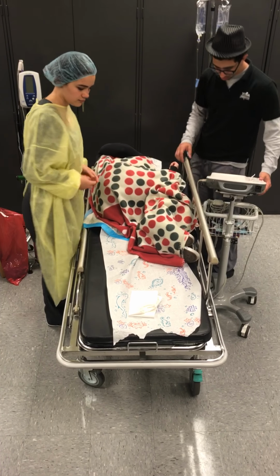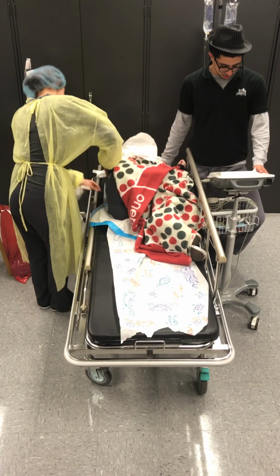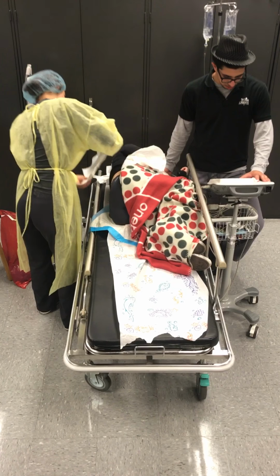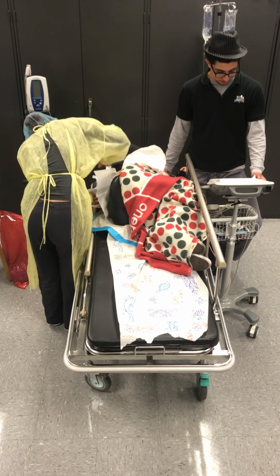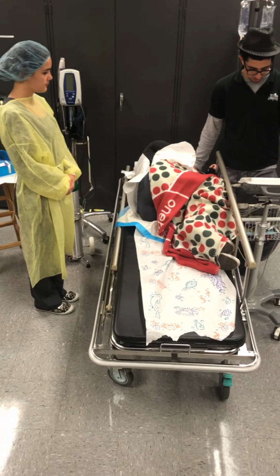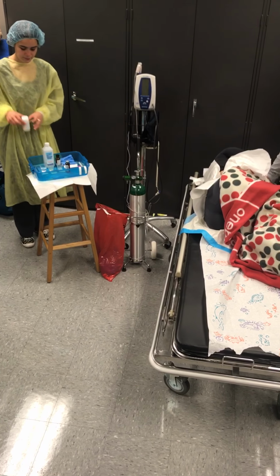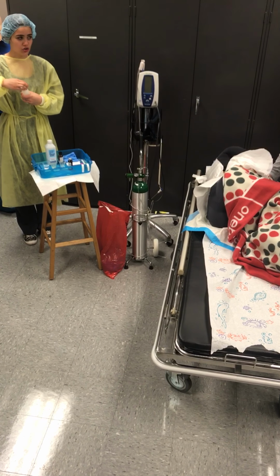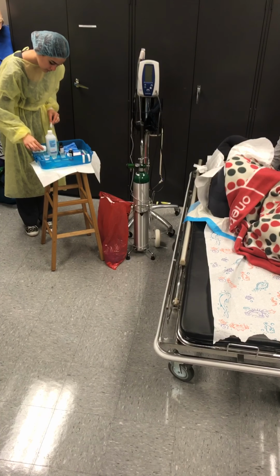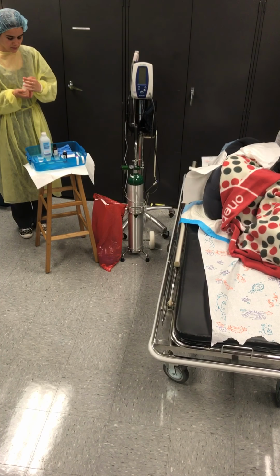Drape patient with glossy out. Open the surgical prep tray and pour sterile water into the provided areas. Okay, sweetie, just breathe. You guys are doing great. Breathe one more time. Okay, sweetie, it's okay.